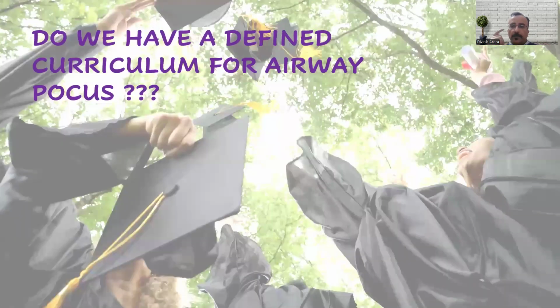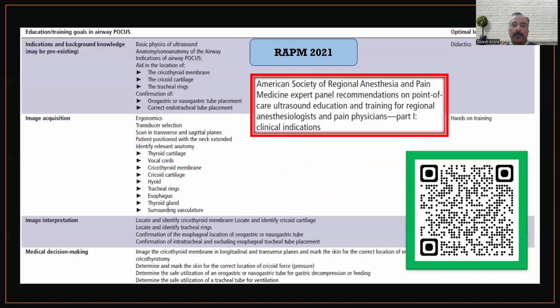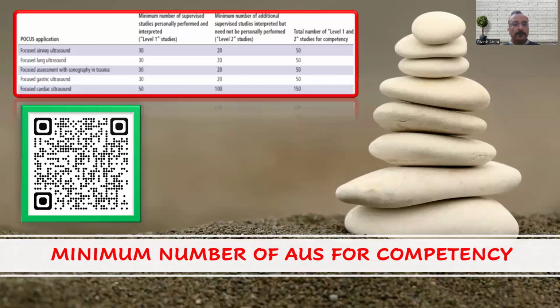The next question that comes to mind is, is there any defined curriculum? The answer is a big yes. The American Society of Regional Anesthesia has published a beautiful article in 2021, and you can scan this QR code where they have actually given why you need to perform airway ultrasound, what are the structures to be identified, how you interpret the image, and how you take decisions. So this is what I have covered up till now. This is what is stated by them.